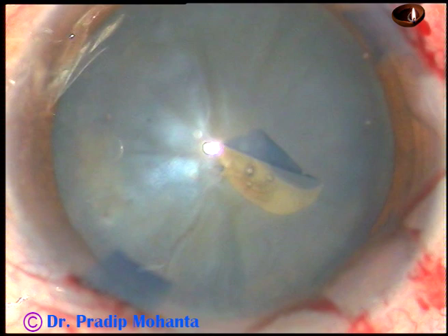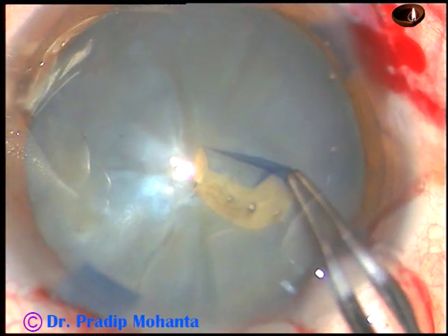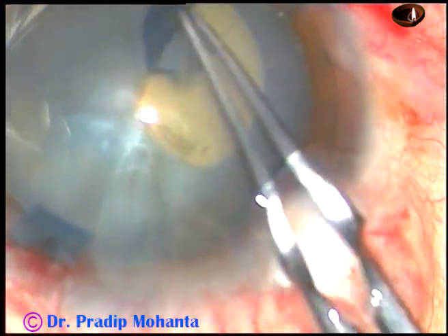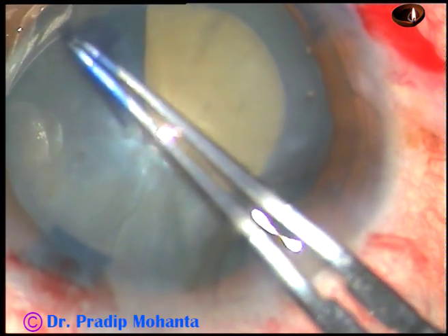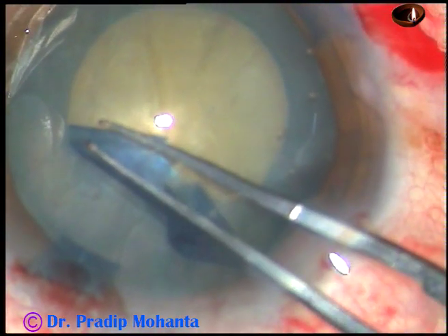The anterior capsule has been incised, the capsular tag has been raised, and now I hold this capsular tag. In this case I am going to do a 5 millimeter rhexis.